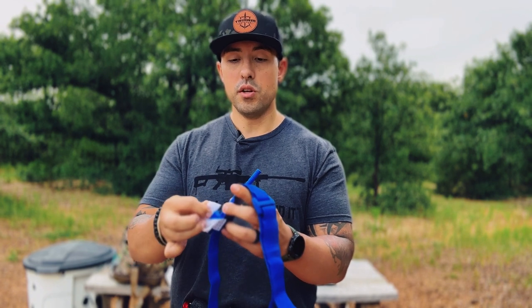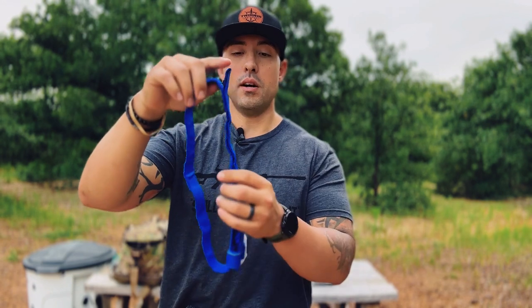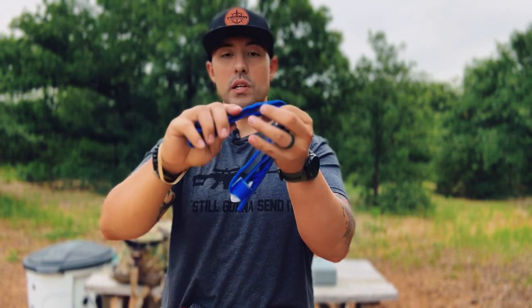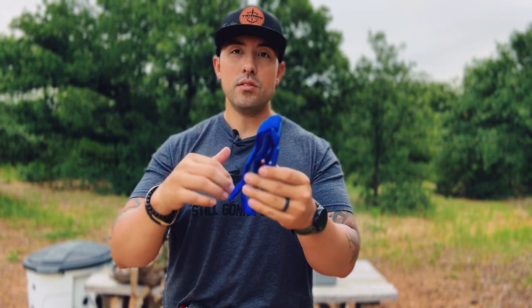Once we have it set up, there are a couple different ways we can stage this for quick and easy deployment. Both methods are great — use whichever one you practice with the most or are most comfortable with. The way most people are taught is to velcro it to itself so it doesn't open by itself. To do this, hold it so the windlass is on the bottom, buckle here, and pull tab on top. Grab right above that buckle, hold it so velcro is on one side and velcro on the other, then fold it down onto itself and squeeze it together so it's velcroed.